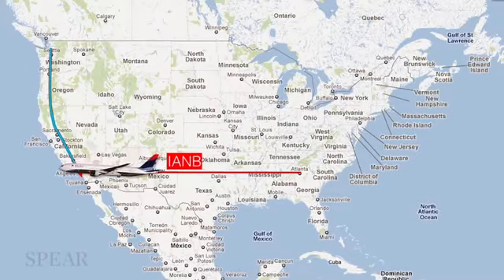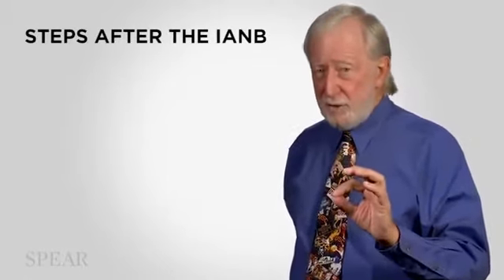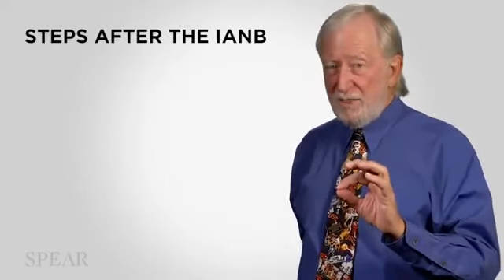Essentially, what you're doing is putting the barrel of your syringe in a corner of the mouth on the opposite side, Atlanta, Georgia, and you're going straight across the mouth to your injection site. So this is one nice way of visualizing the traditional inferior alveolar nerve block. It doesn't give you everything. It doesn't give you anesthesia of the soft tissue in the buccal fold that is distal to the mental foramen.